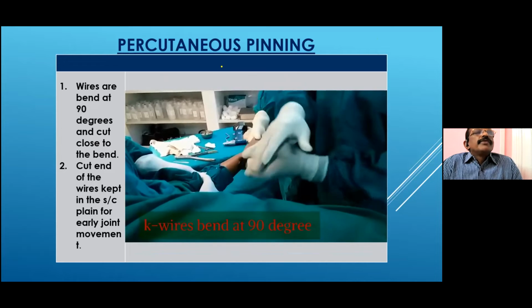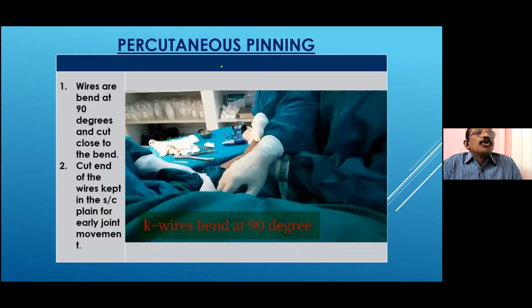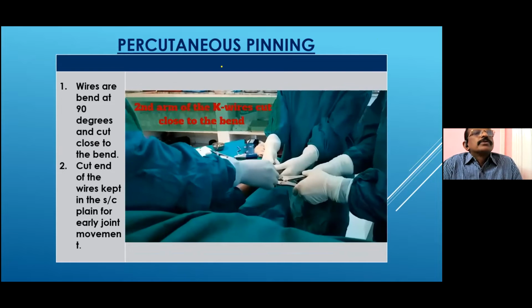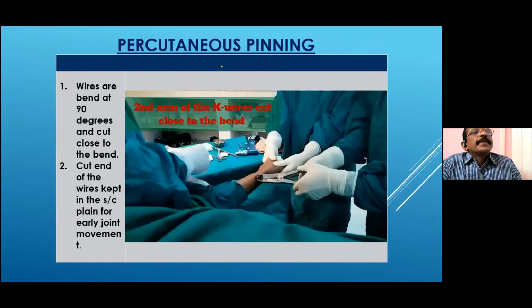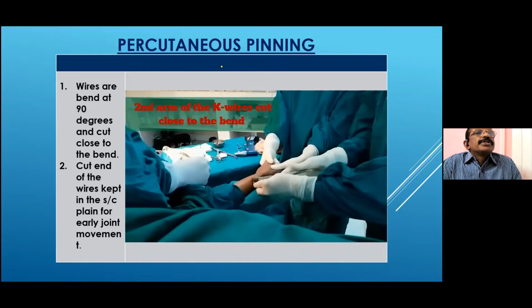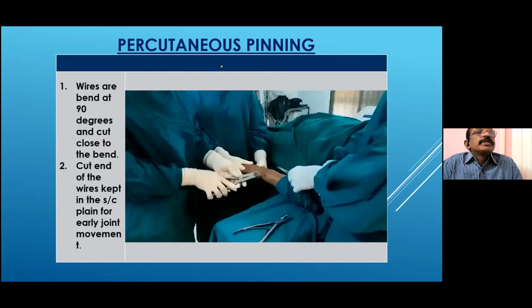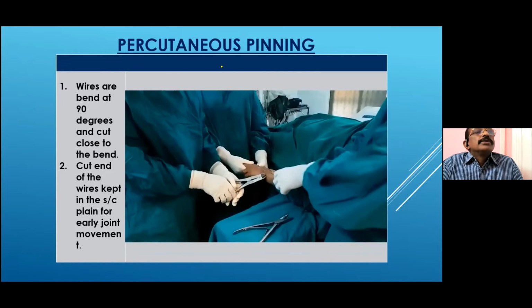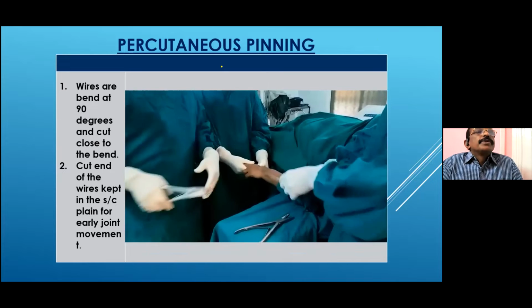The leverage will be given by pressing towards the bone, deep pressure through the skin and subcutaneous tissue, so that it will not move. The protruding ends are cut close to the subcutaneous tissue, that is by giving a pressure through with this curved cutter. This is a curved cutter so that we can give the pressure to the skin.